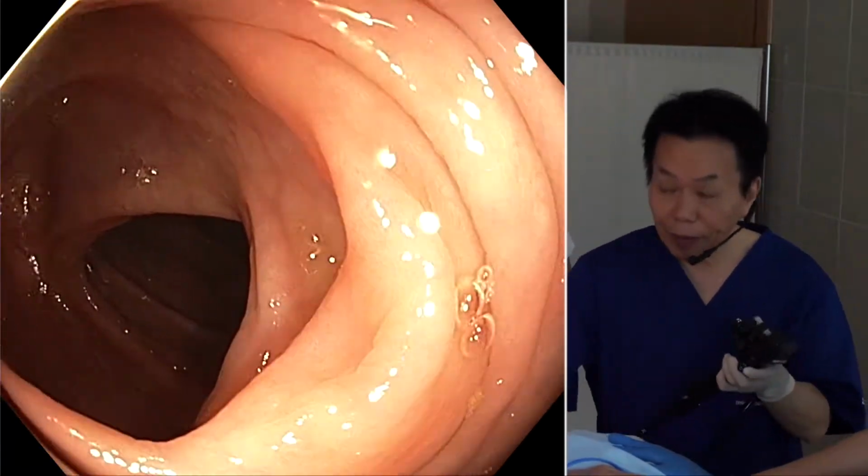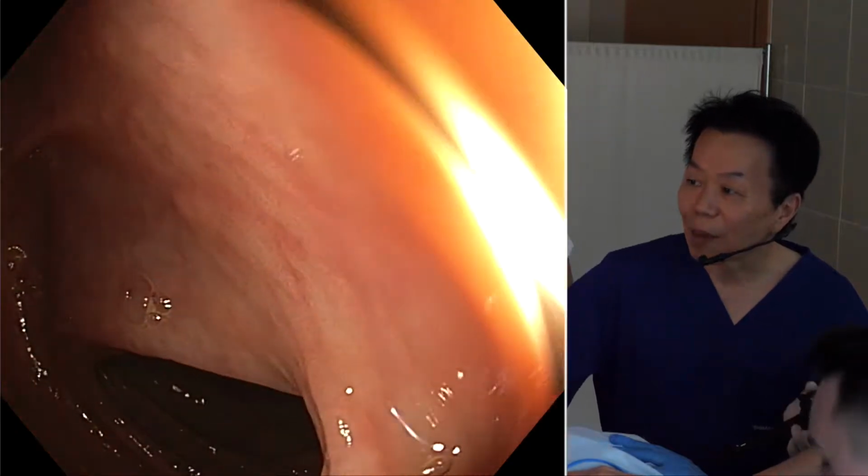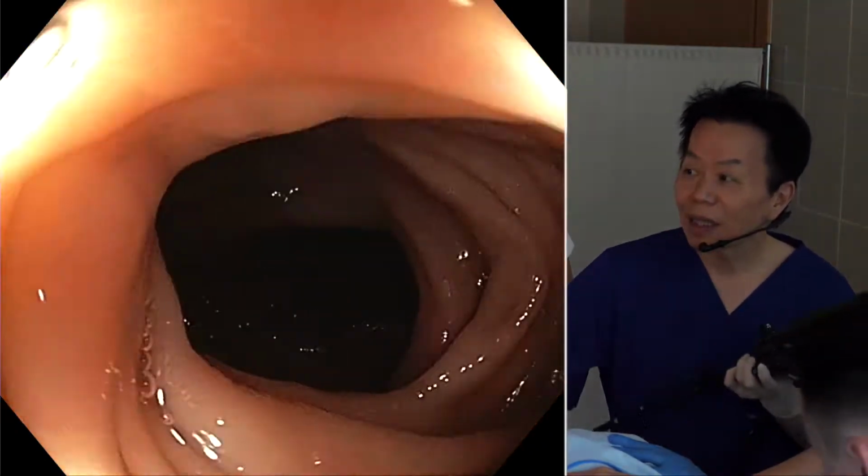At the splenic flexure, I often use this technique too, but still you can see the paradoxical movement. In that case, maybe I can try right decubitus position or hand pressure. Maybe I'll try right decubitus.